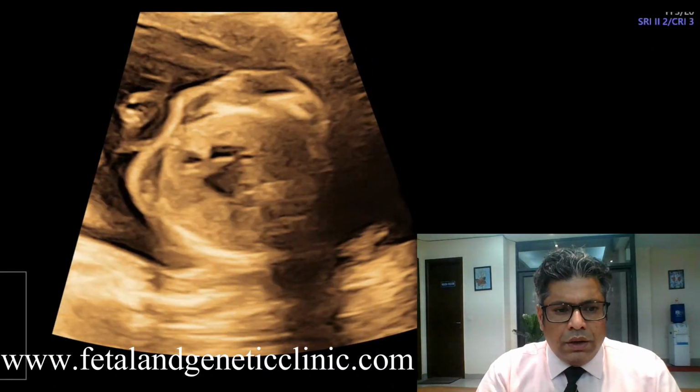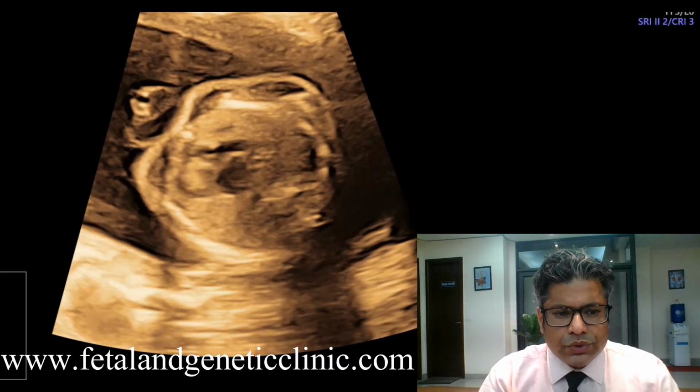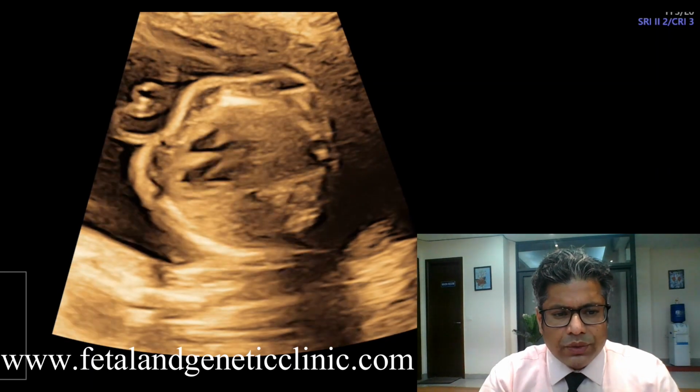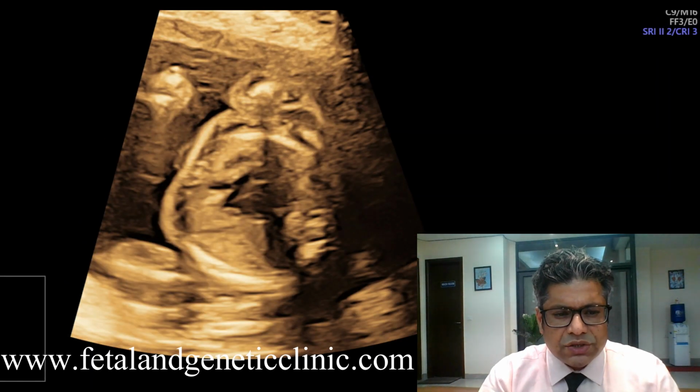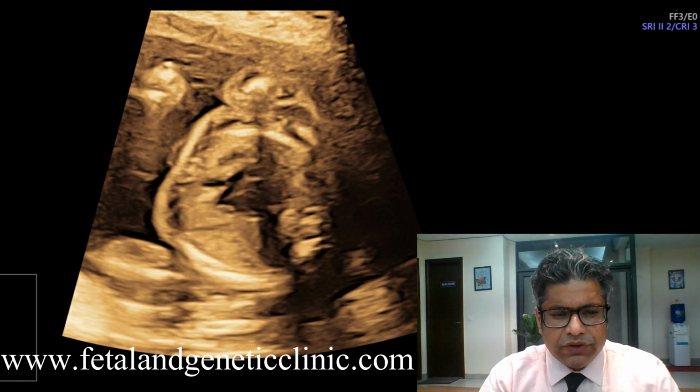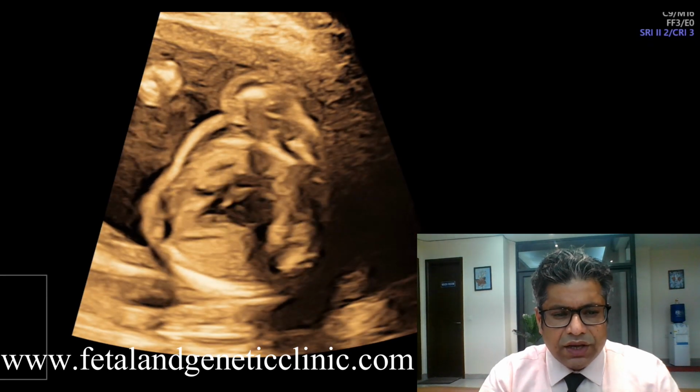So I am going to show you one case. तो मैं ये केस दिखा देता हूँ, तो इसको आप अगर ध्यान से देखिए तो we can identify कि overriding aorta है over the IVS. So if you look around, the interventricular septum has got an overriding aorta and it is opening in both the right as well as the left ventricle, right?